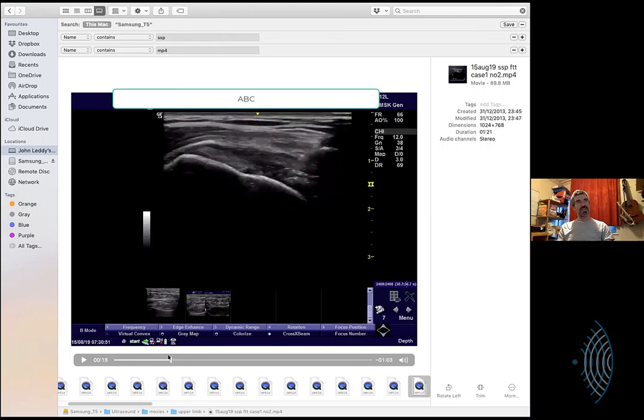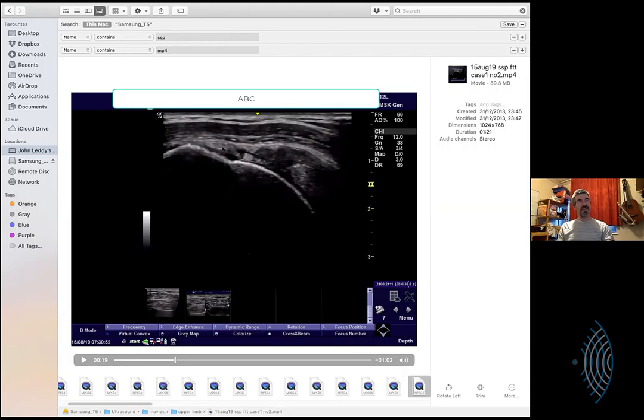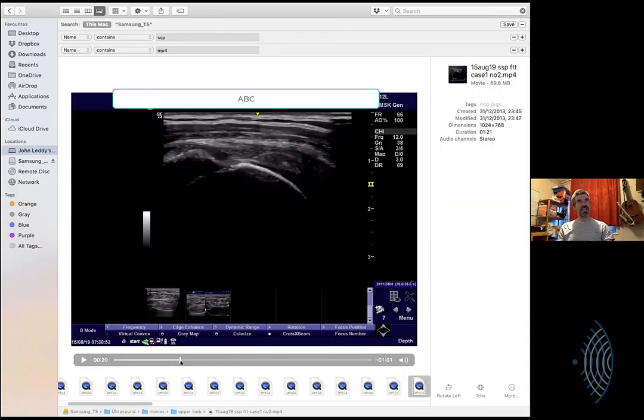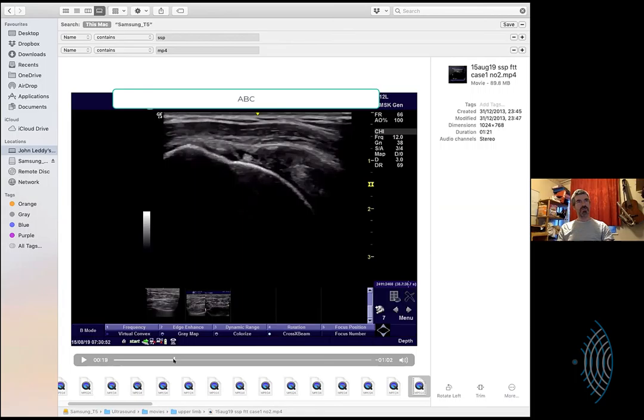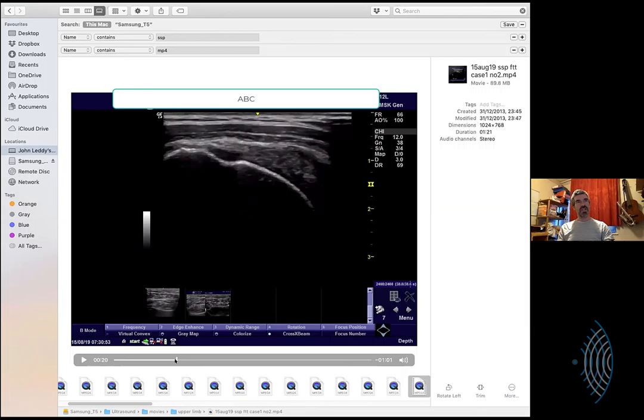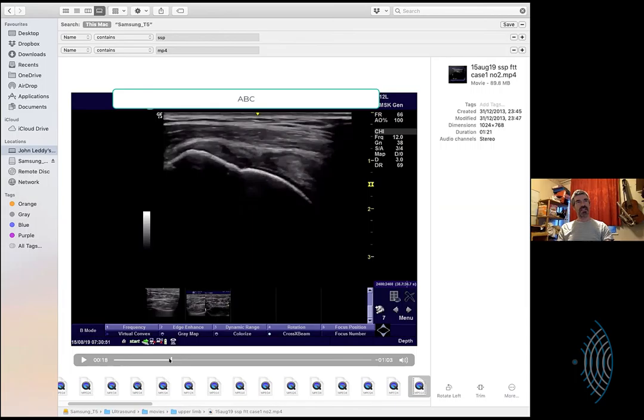We see the deltoid dropping down into the space. Yep. Oh, and looky there. Yeah, there's the infraspinatus coming off there. You can see it's slightly oblique. Do you see? Yep. See that section there? You see these fibers, let's freeze that. These fibers here. When I move through, can you see that they are, hang on, let me think there. This section here, I'm going to tell you that I think that's oblique. So I know I'm in true long section. There's the biceps. Yes. Long biceps. So this is long in supraspinatus.